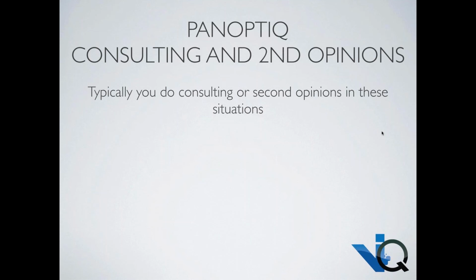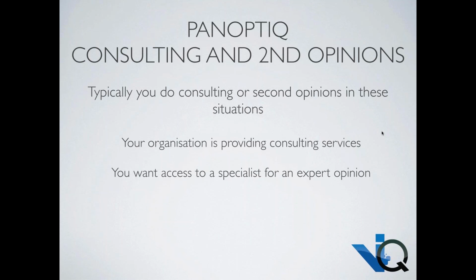Or you're in a situation where you have a patient transferred into your organization that's got pathology done somewhere else, and you are wanting to review that pathology prior to surgery. And in that last case, often I think in many cases, you have to get new slides cut at the remote location and then get those transferred in so you can have your local pathologist review those as well.